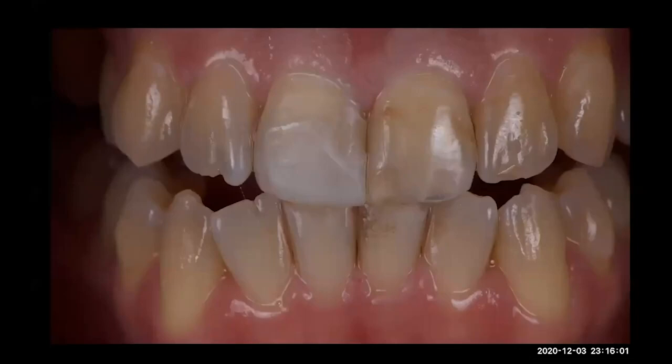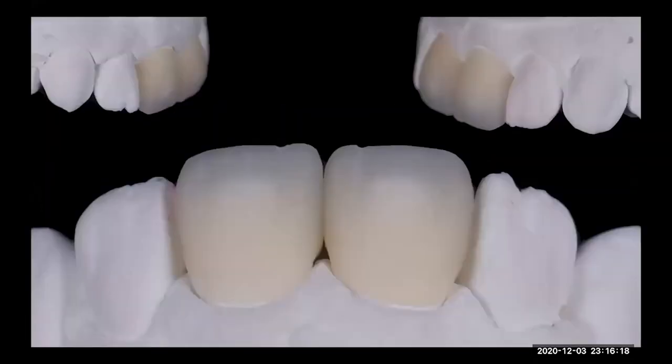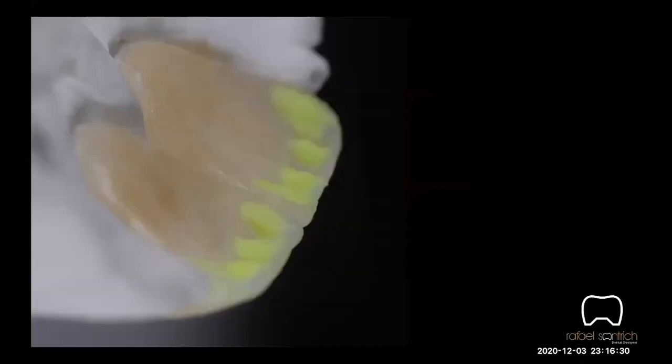And this is a nice case that we did using two kinds of technologies. We did CAD-CAM technology using two different materials, because I think it's important to understand what happens with each material. So we used Empress and we used e.max CAD. And we did the same: we did the internal stain from inside the concavity. We did the external stain, following some characteristics of the restoration. And then once the glaze is finished, we need to follow.